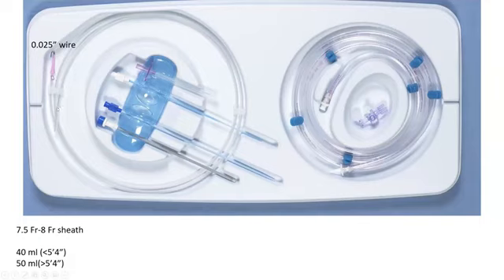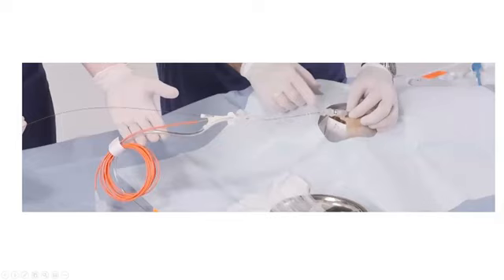Then eventually you advance your balloon pump over a 0.025-inch wire. Don't advance it too deep because it's not a long wire. So you advance it, then you load the balloon pump catheter over it, and you advance over that 0.025-inch wire. Now, some tips here.